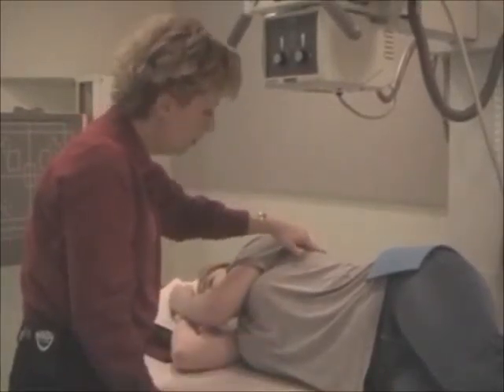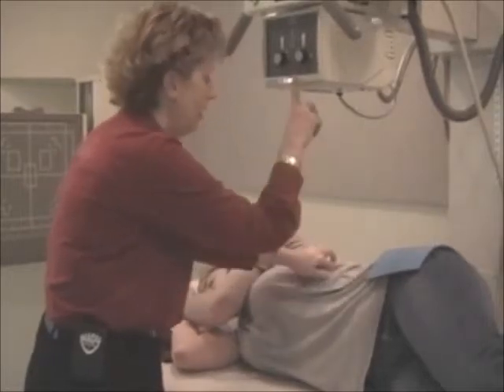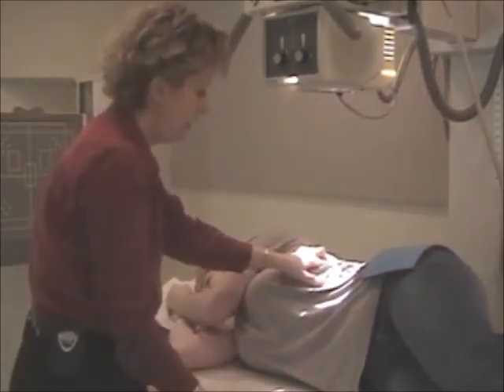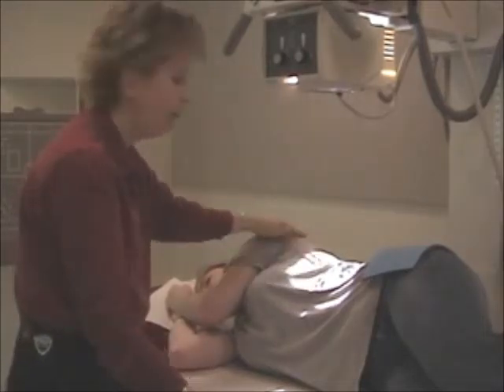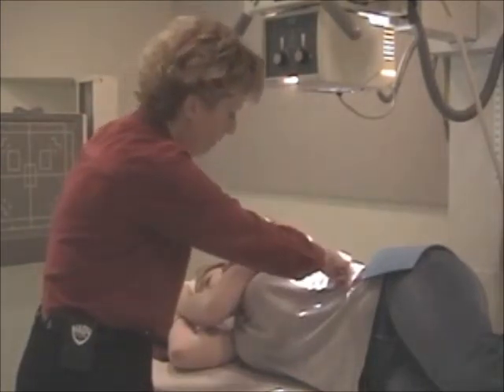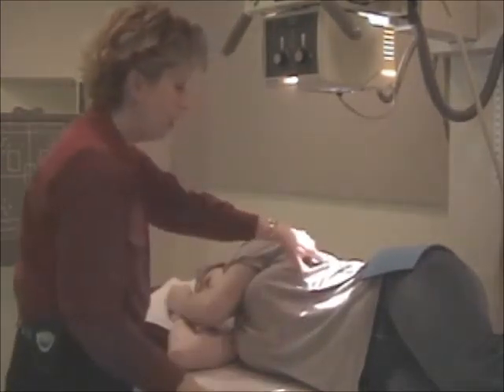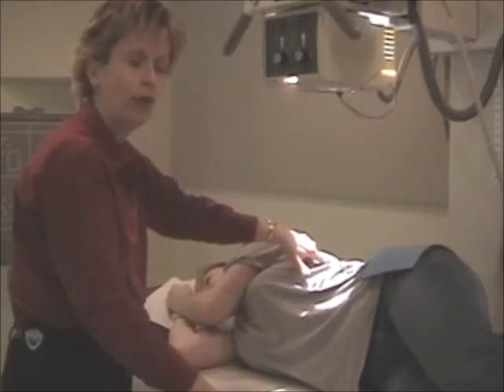And again, it was the tip of the scapula, iliac crest, halfway, and then a little bit below. I think I failed to tell you a minute ago that you should go an inch below. So let me recap. Tip of the scapula, iliac crest, halfway, and 1 inch below. That will put you at the level of lumbar spine, L1 or L2.